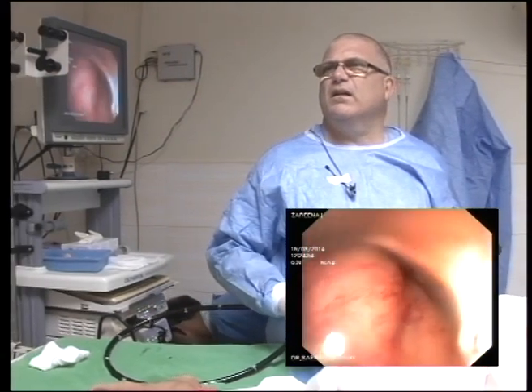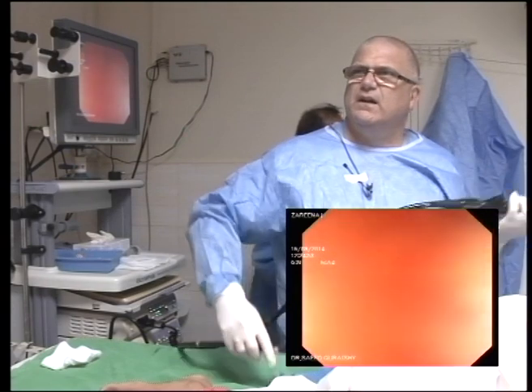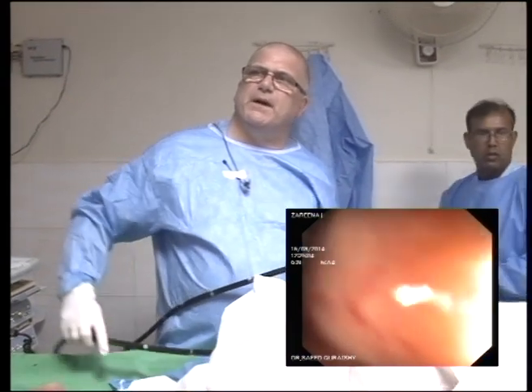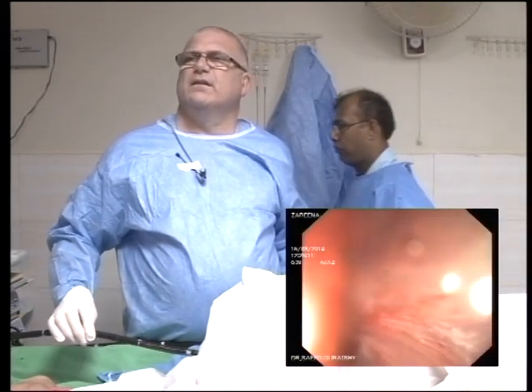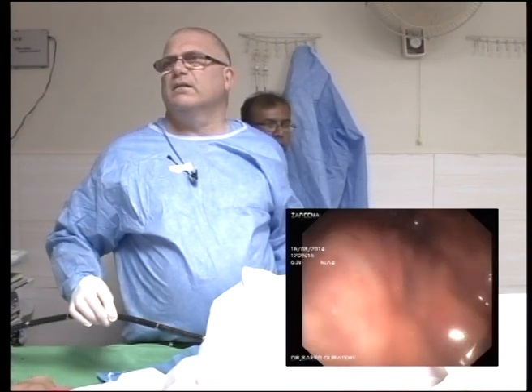Yeah, use the well technique. So what I'll do, I'll demonstrate the technique for doing it. She's also a lady that they've done anastomosis not so far up, but we'll take this biopsy and I'll show you how I do it. Quite sore that is, isn't it? It is, yes, it's very colitic type mucosa.